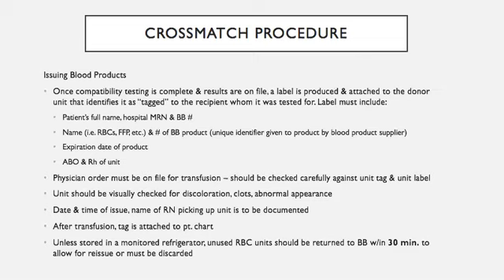If they don't get returned within 30 minutes, or if it is longer than 30 minutes and they're kept in a monitored refrigerator, that would be an exception. Otherwise, we have to discard that unit.